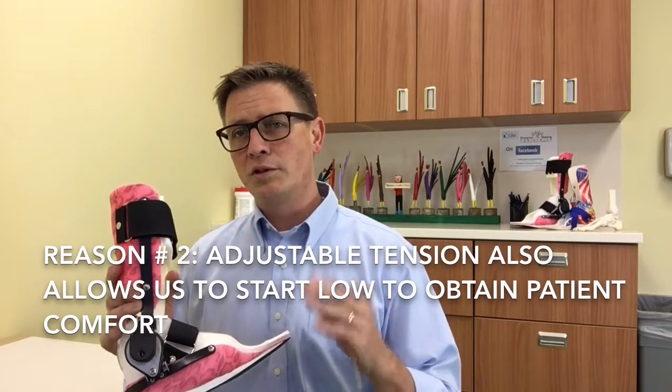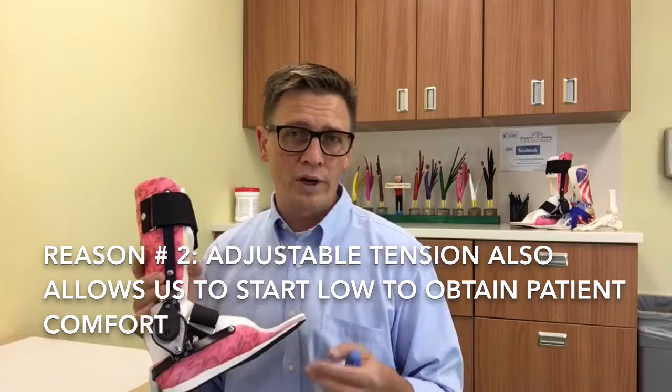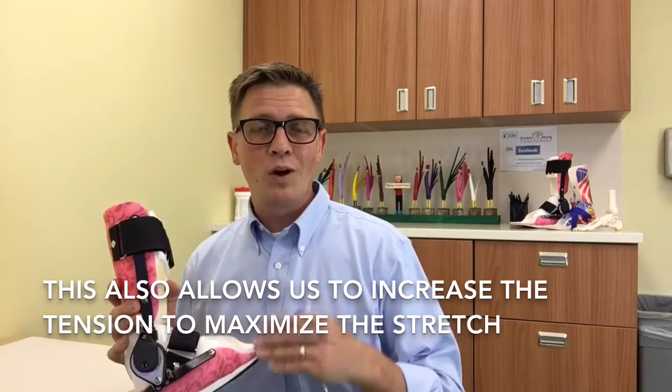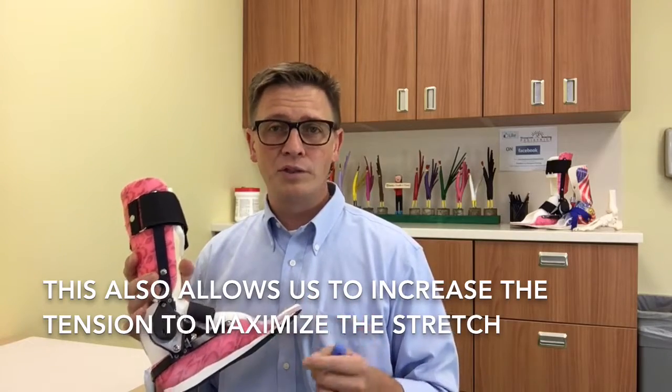We want to make sure that the tension is low enough so that it's comfortable for the patient to wear and comfortable enough to sleep in, but we also want to be able to turn it up so that we're doing the most good and getting the most benefit within that comfort range possible.